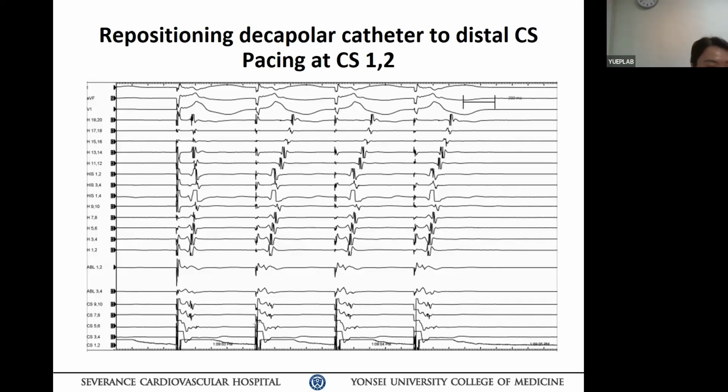Dr. Wang, actually the coronary venous pacing is quite useful in my practice, but I always have a curiosity. It is valid because it is epicardial pacing, far away from the endocardial Purkinje system. So, right. Is there something to consider when we do the epicardial pacing during the basic EP study?